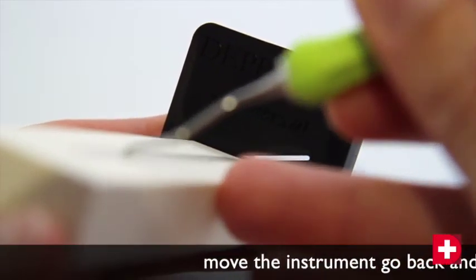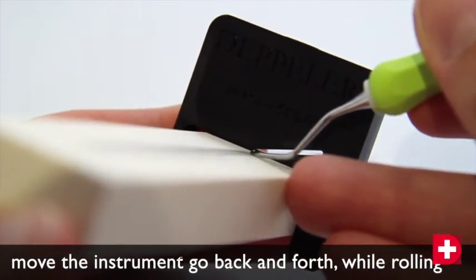After two back and forth movements, the color should have disappeared completely.